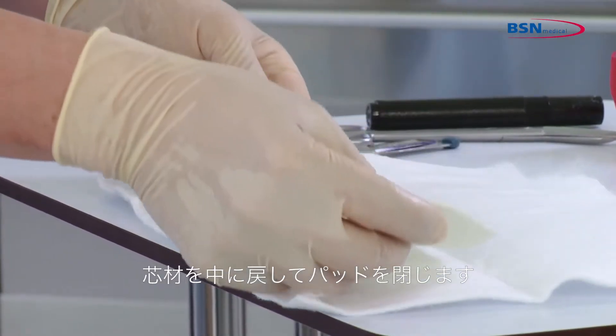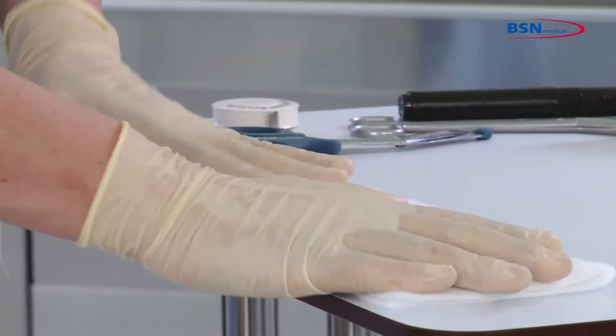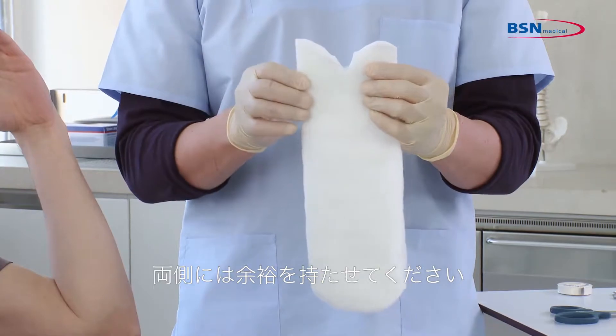Place the substrate back inside the padding and close it again. Then cut the padding in the middle following the triangle shape of the substrate gap and leave a margin of padding on either side.